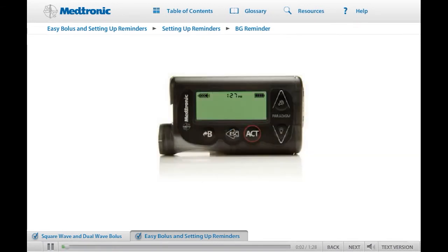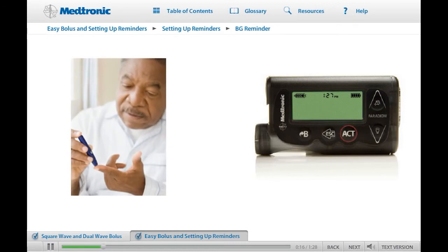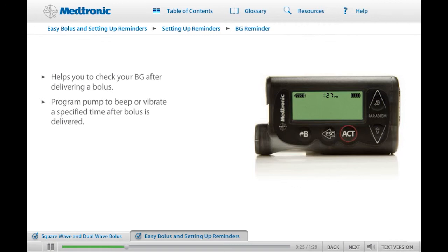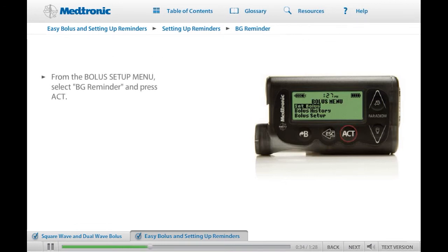The BG Reminder feature can be used to remind you to check your blood glucose a specified length of time after a bolus has been delivered. When you deliver a bolus, you may want to check your blood glucose an hour or two later to make sure you gave enough insulin. You can program the BG Reminder to beep or vibrate at a specific time following a bolus. To use the BG Reminder feature, you first need to turn it on. On the Bolus menu, select Bolus Setup, select BG Reminder, and press Act. You will now be on the BG Reminder Setup screen.